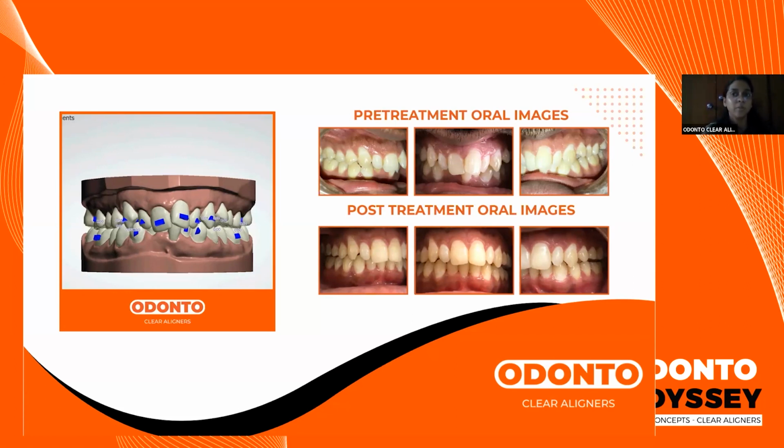What kind of movements can be brought about with aligners? What kind of movements are aligners restricted to, for example in deep bite cases? They don't always work out, especially if it is a skeletal deep bite. They're very difficult to treat even with aligners, and even with conventional braces it's quite difficult to treat a skeletal deep bite. So if aligners are something we're looking at, that needs to be checked, because they don't always work out. To what extent can you use an aligner to correct that bite? That's something you will learn in the aligner program.